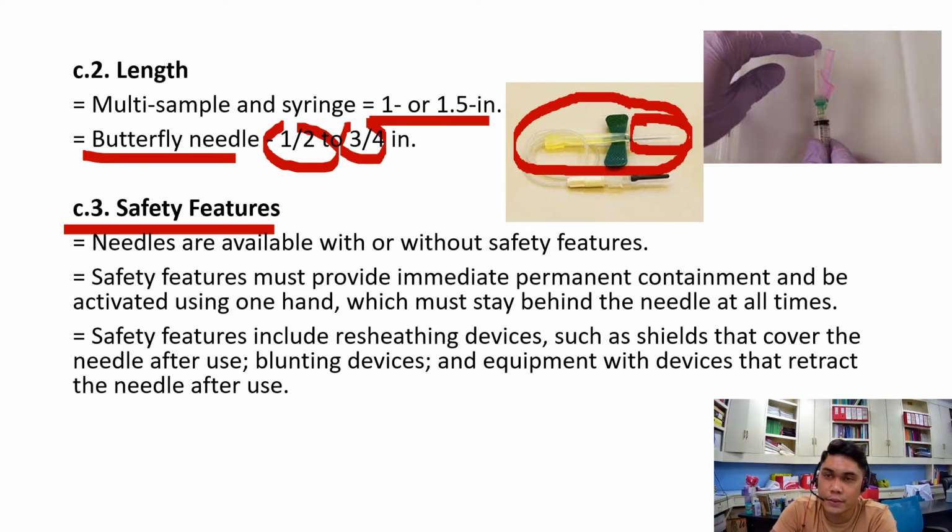Another example is this one. So safety needle. So after collection, just push this one to cover the needle. Okay, so to avoid needle stick injury.